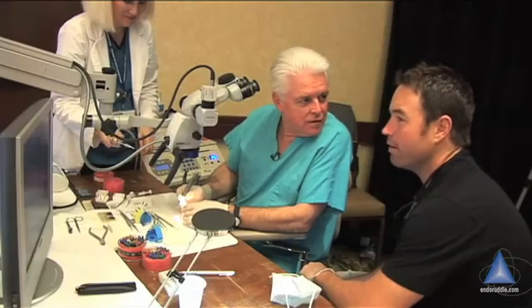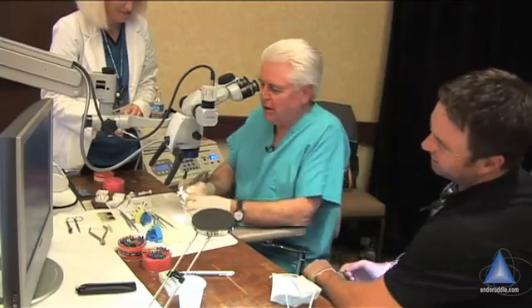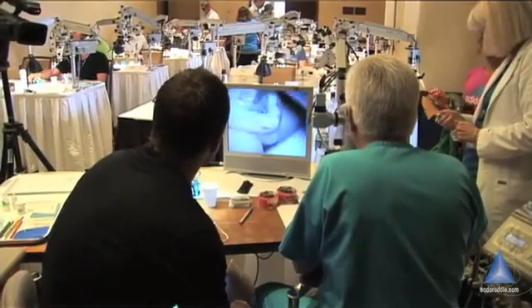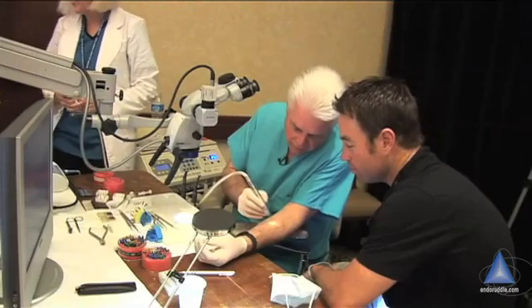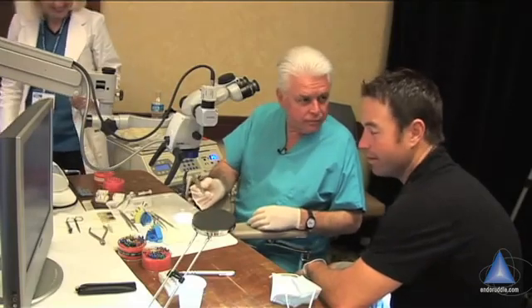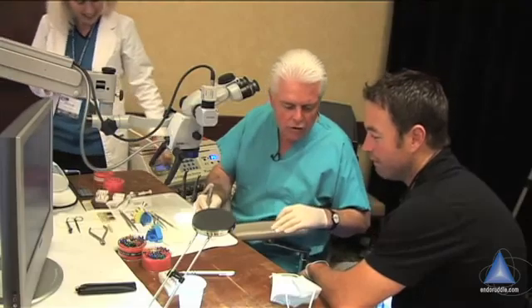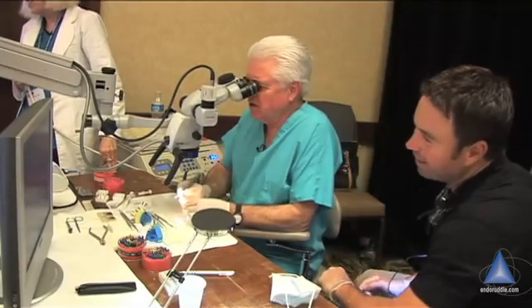You were right there, but like most dentists you're ready to go to the next step. See how flat the walls are now? I didn't take all this out just to say I did, but more or less that's a big flat table all the way across. I cleaned up your floor a little bit. I run this diamond sometimes just to feather — when you're doing floor work it's just like taking a piece of sandpaper, doing a little finish job.